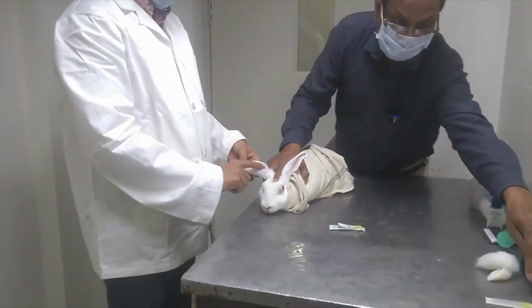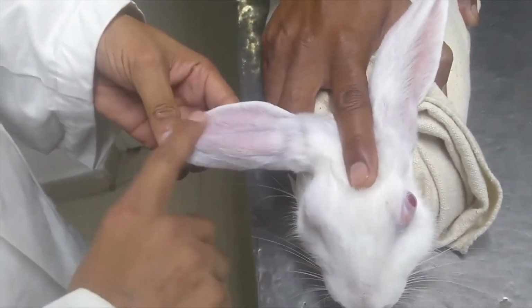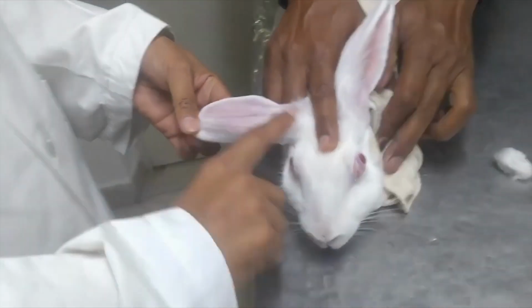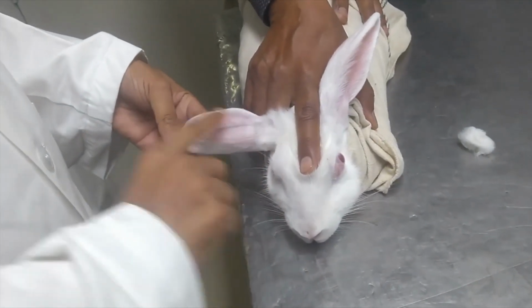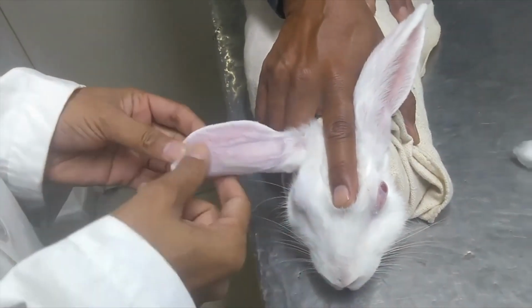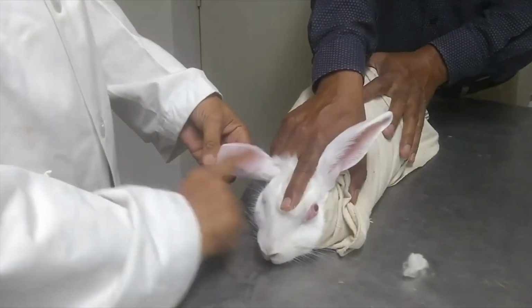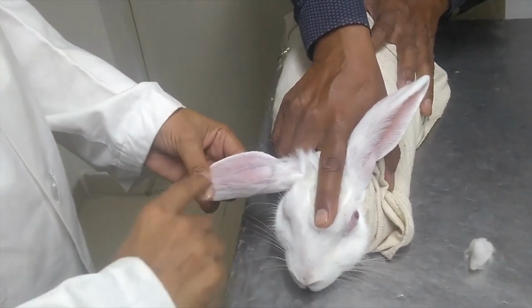We will bleed the animal from this mid-ear vein, and we rub it so that it gets heated up and the circulation is faster. The vein will also expand and more flow will be there. So this is the method which is normally applied. When the vein is properly visible, this is the mid-ear vein from which we will bleed.